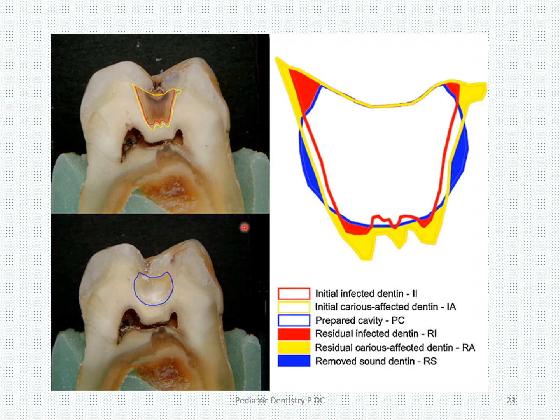that you have to get rid of the infected dentine, especially at the corners of your preparation. That means your cavo surface areas, you have to get rid of them. There should not be any overhanging enamel margins in this area because they will be protecting this part of infected dentine. Okay, so if you see, this area here is what is shown here. So once you're doing caries excavation, ensure that the cavo surface is nice and clean.